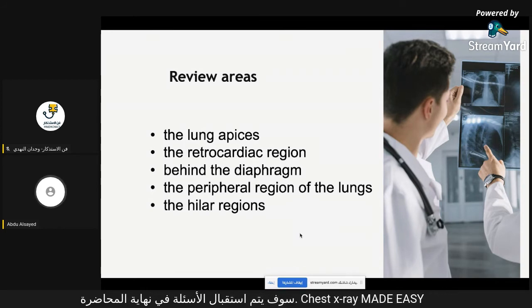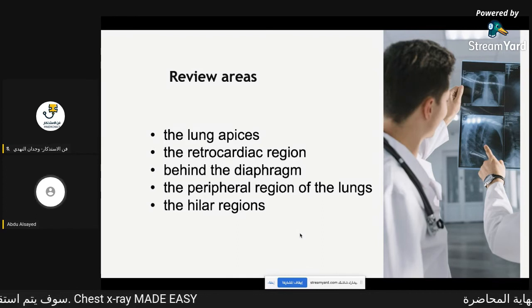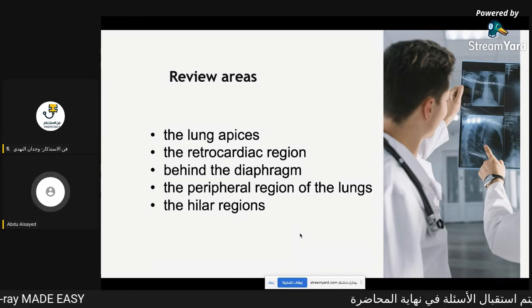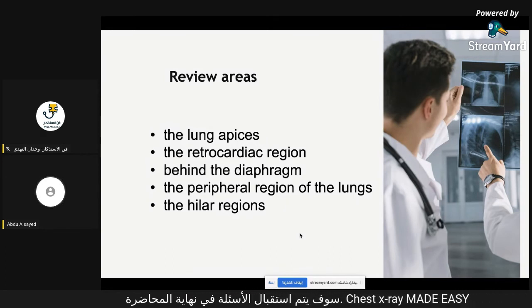Always, one view equals zero view. We should comment on the lateral. We should do two views, not one view. Always.